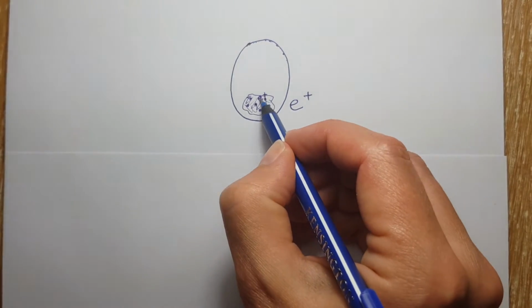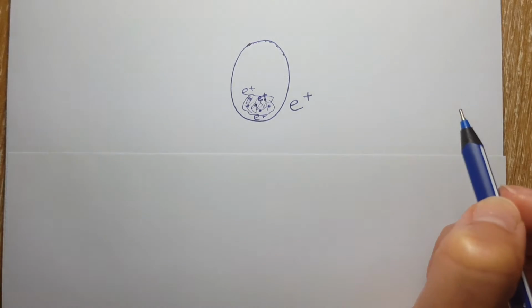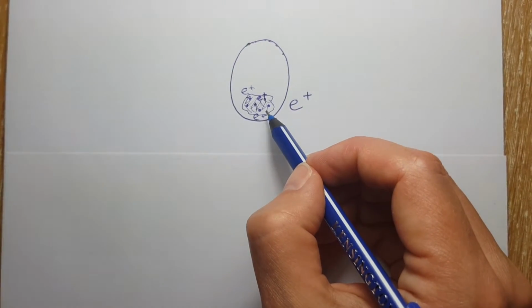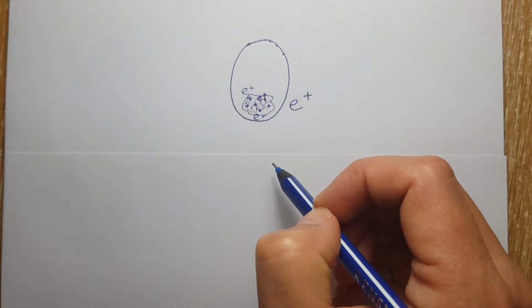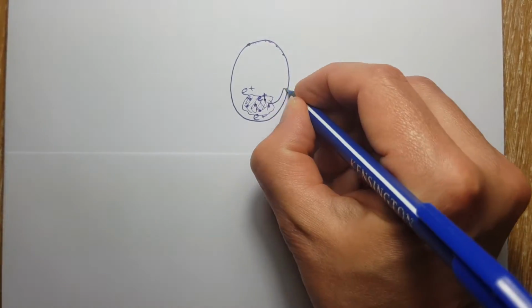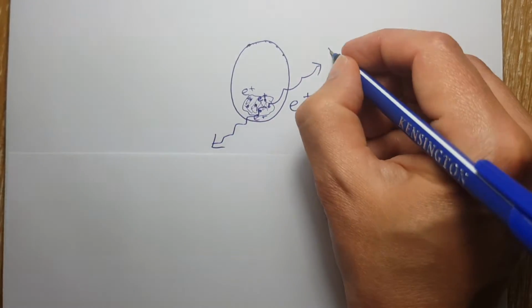So these positrons that are being emitted in this part of the brain, they are going to meet electrons virtually immediately. As soon as they meet an electron, they're going to annihilate. And when they do that, they create two gamma photons, in opposite directions.